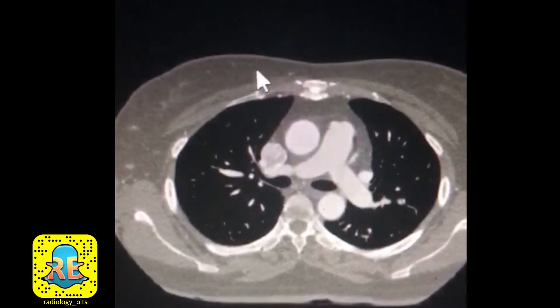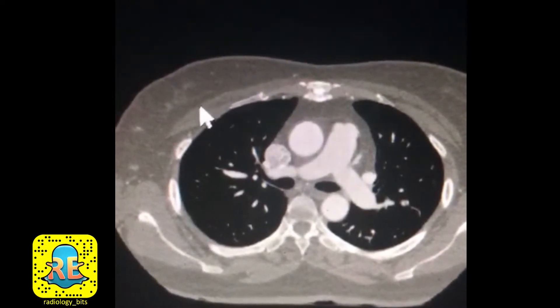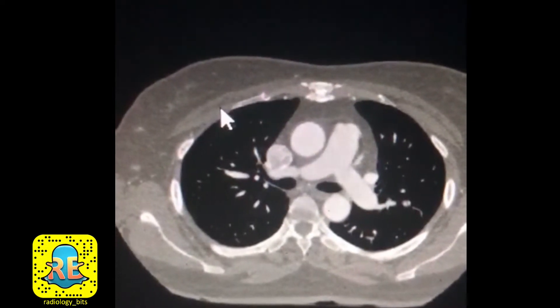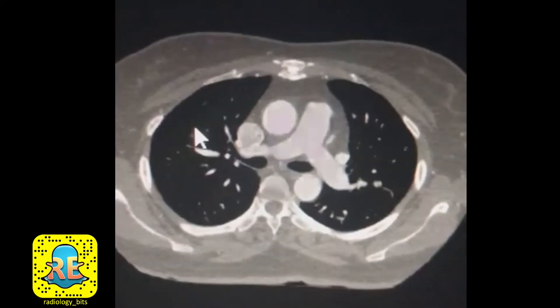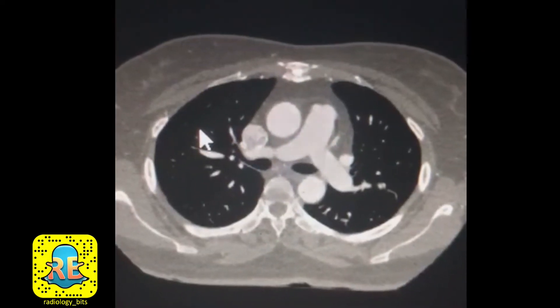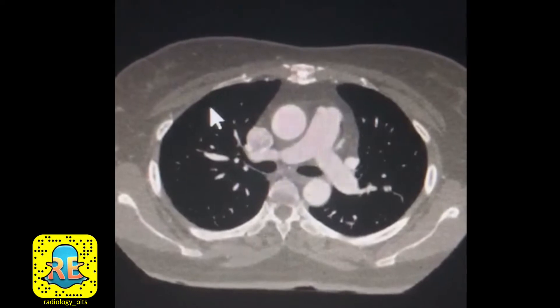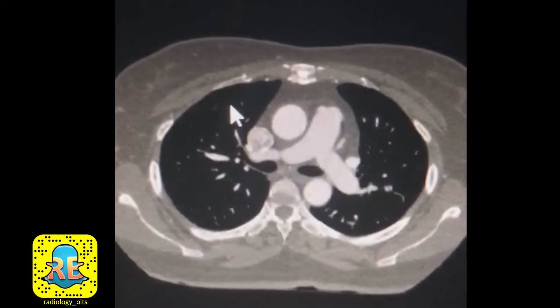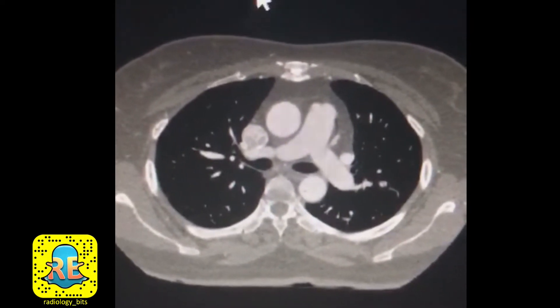Subcutaneous fat is darker in comparison to the muscles, but not as dark as air. As you can see, air in the lung is very dark — it's as dark as air outside the patient.